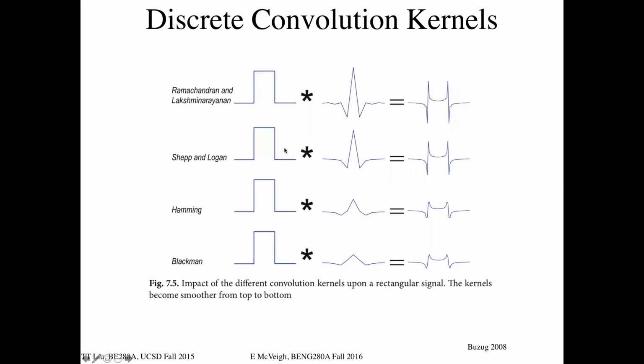Batman ears. And then as we go to filters that roll off higher frequencies, this is what the convolution starts looking like, and then the object itself goes down. You can't totally get rid of these negative lobes, right? Otherwise, you're just back to where you started, which was that blurrier picture. Okay, so that's 12:14.